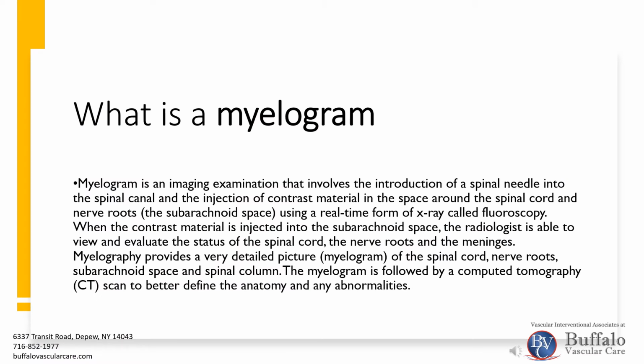Myelogram is an imaging examination that involves the introduction of a spinal needle into the spinal canal and the injection of contrast material in the space around the spinal cord and nerve roots using a real-time form of X-ray called fluoroscopy. When the contrast material is injected into the subarachnoid space, the radiologist is able to view and evaluate the status of the spinal cord, the nerve roots, and the meninges.